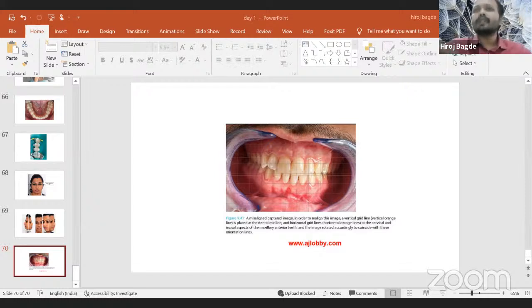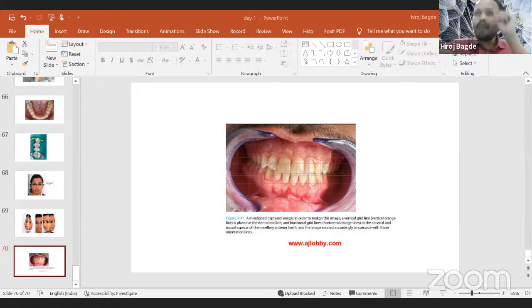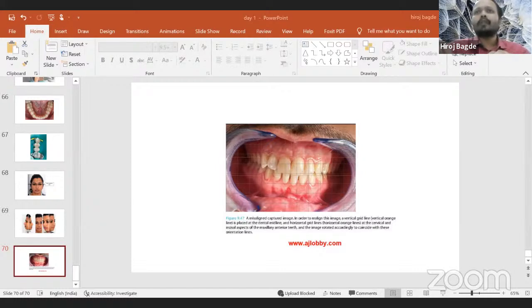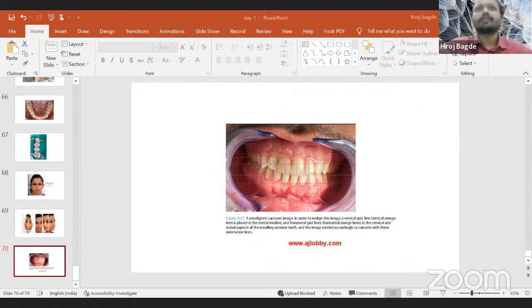There are definitely changes — good changes. White light, reddish nature of the gingiva. We are having changes in the histogram. What I have done is pick something called neutral using the neutral color picker. Just see — it was totally yellow. You go and hit the neutral color picker, then go and hit the yellow-white area, and see the dramatic changes. You will have a pleasant image here. That one was totally yellow; this is now natural color. The histogram is not that much uniform yet.